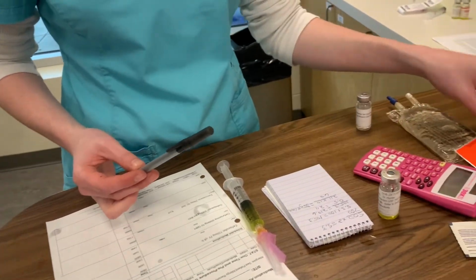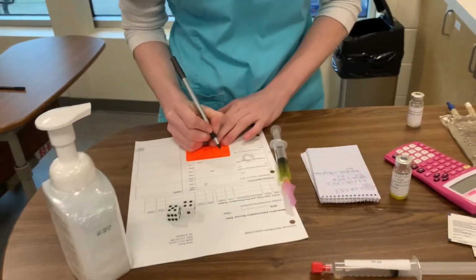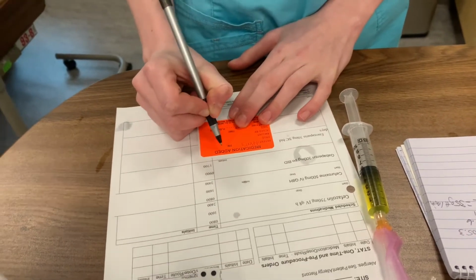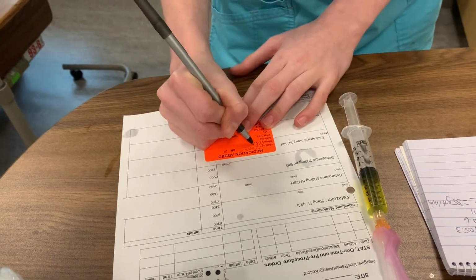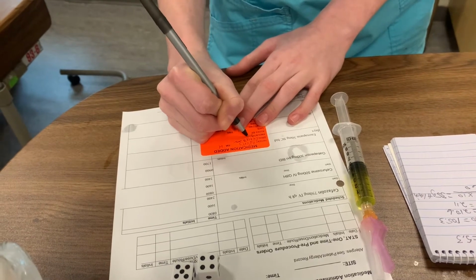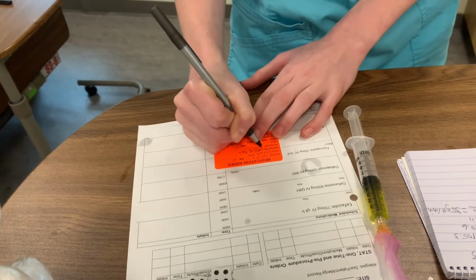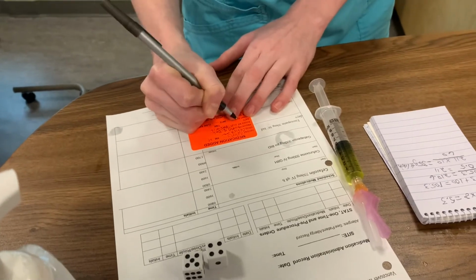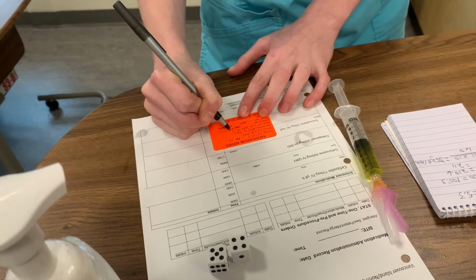And now I'm going to do the medication sticker. All right. A. Perry, room number 4, drug (500 milligrams in 5.3 ml), added by Gabby Hawes, PNS, NIC, on today's date at 0800.